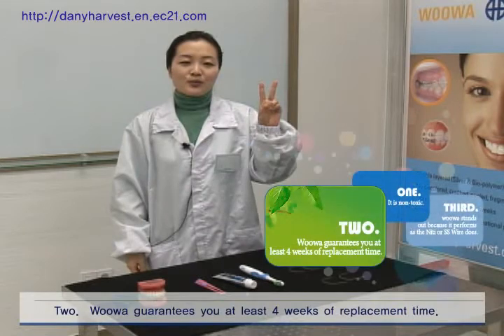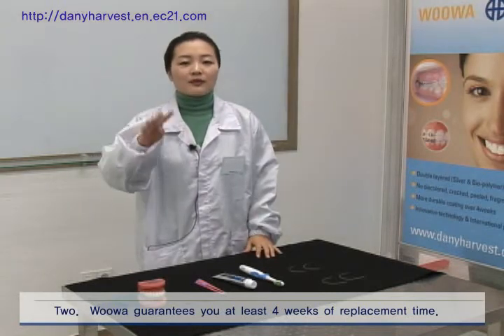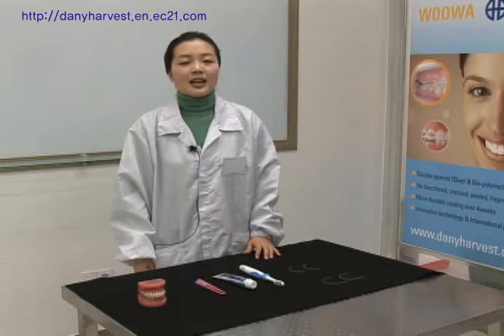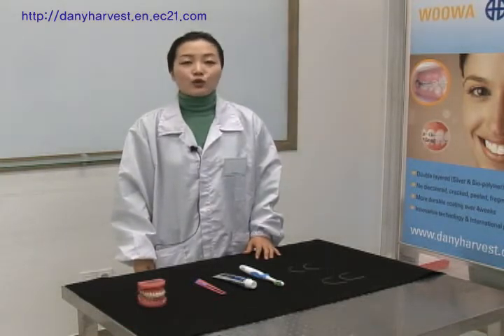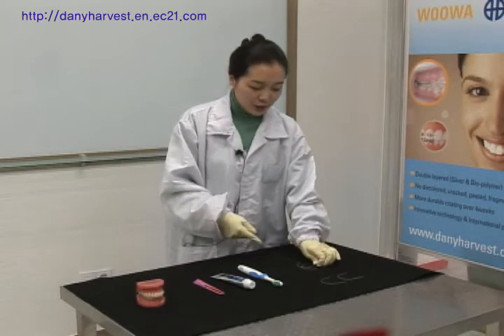Two, UWA guarantees you at least four weeks of replacement time. I'm going to perform a peel-off test that orthodontists use — they twist the wire and rub it together to see if it peels off easily. This is UWA. I'll rub it 20 times.